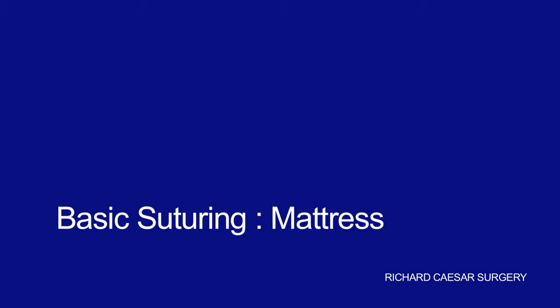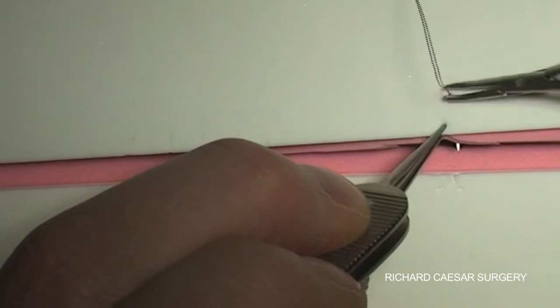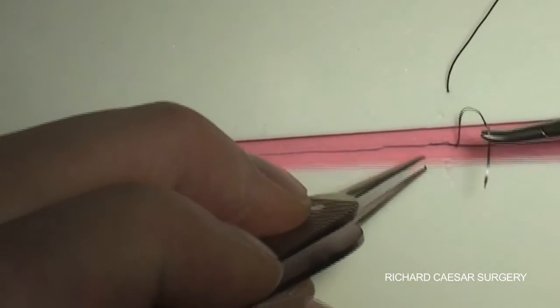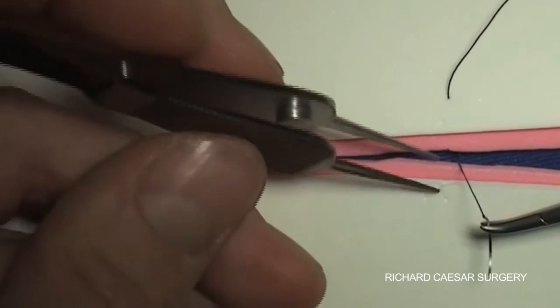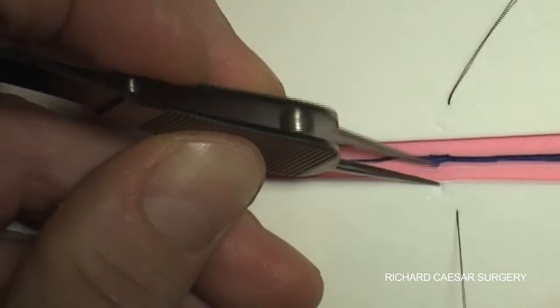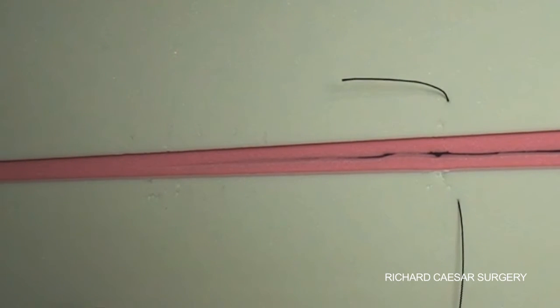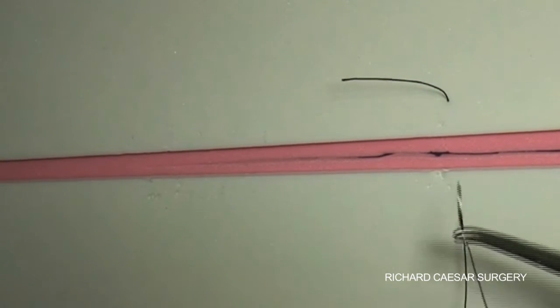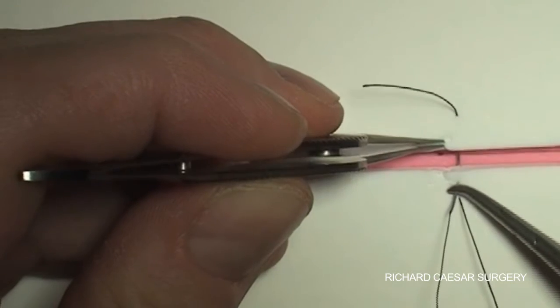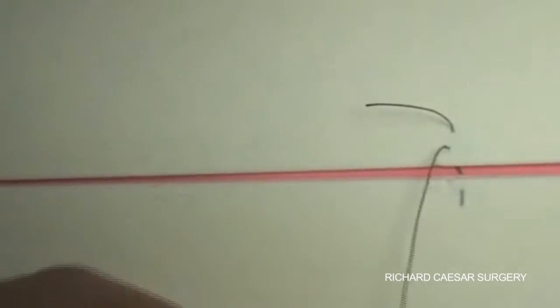The mattress stitch is a nice technique for bringing together both deep tissues and the skin. With one stitch, you can achieve a deep closure as well as skin apposition. Imagine that the pink foam is the deep layer and the white foam is the skin. You pass through both layers on each side, taking a large bite, then backhand the needle, and on your way back just pick up the skin.